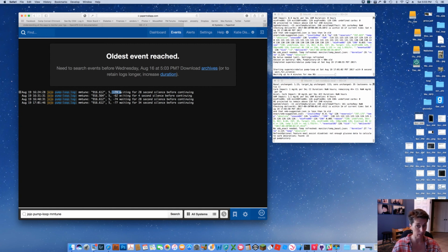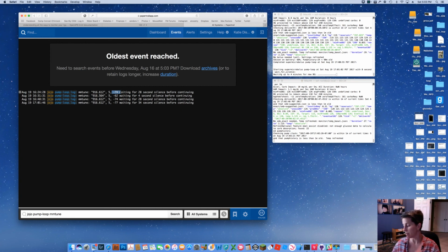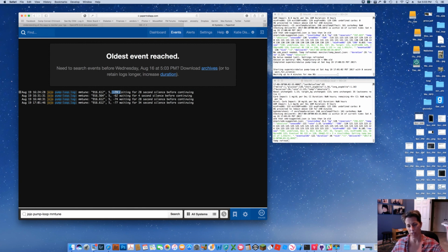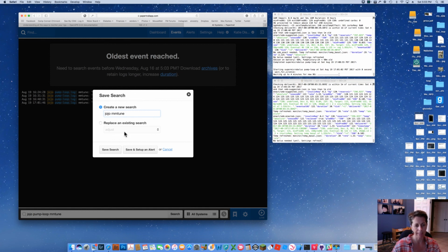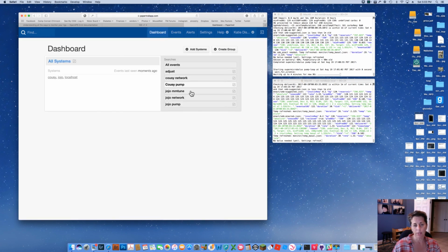The battery's low, it's too far away, your Explorer board might be bad. If your Explorer board and pump have to be only inches away to work, your Explorer board is likely bad. So basically, these should not have to be this close to work. They should work across the room. Basically, so you can get a result of these. I usually save Tunes because I like to periodically check how those are doing. Jojo Tune. You can save those. So you can build all those into it.